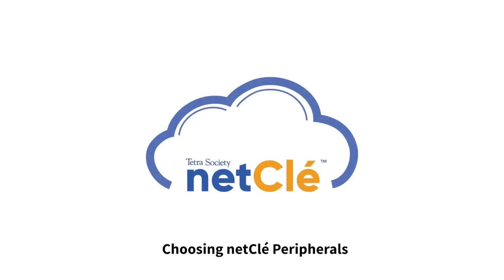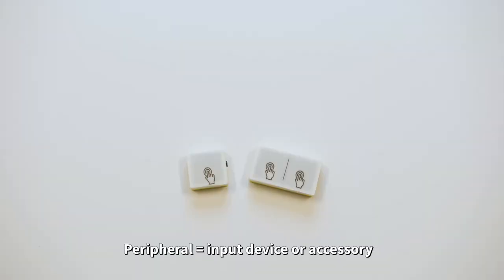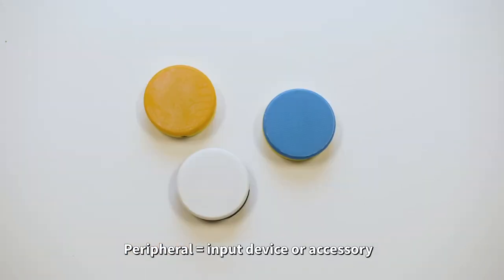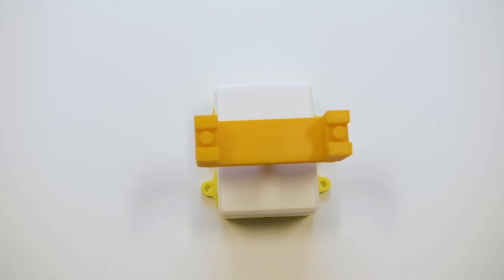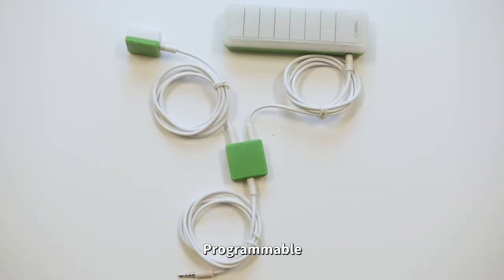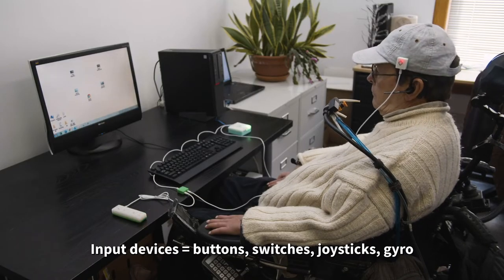There are many peripherals that can interface with NetClay. Each peripheral can be programmed to operate on its own and perform key control functions, such as moving the cursor and clicking. Or, two or more peripherals can be connected at once to each perform a separate function. Choosing a solution depends on each user's unique needs.